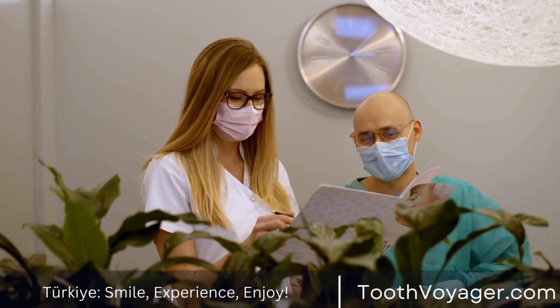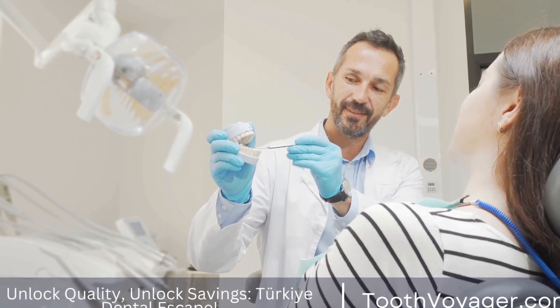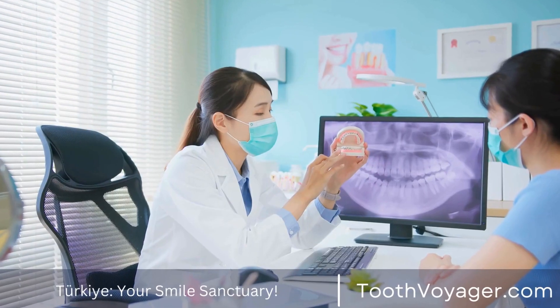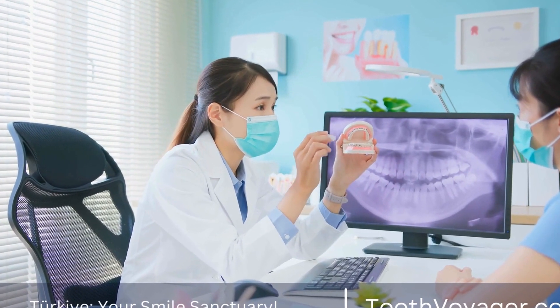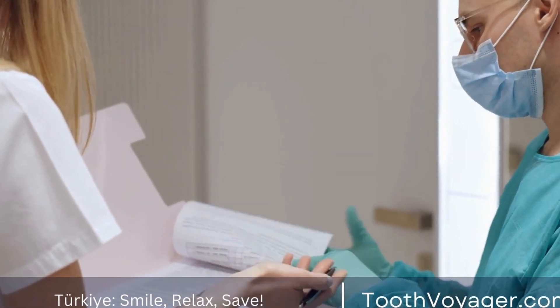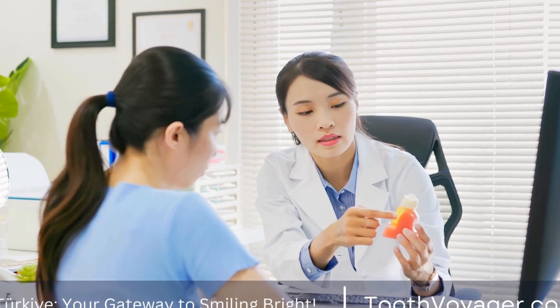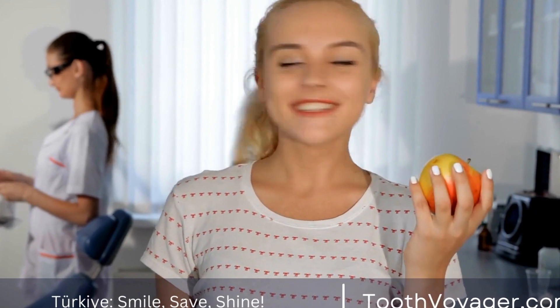Step 2 – Implant Placement. Once the treatment plan has been established, the next step is the implant placement procedure. This involves surgically placing the dental implant into the jawbone. The implant acts as a replacement for the tooth root and provides a stable foundation for the final restoration. Local anesthesia will be used to numb the area and ensure your comfort. Your dentist will then make an incision in the gum tissue and drill a hole into the jawbone, place the implant, and suture the gum tissue closed.